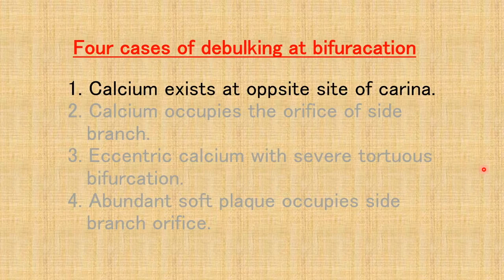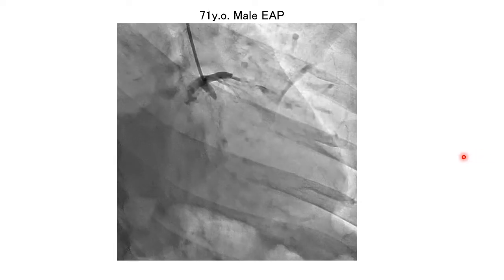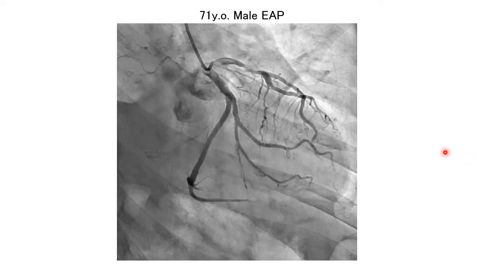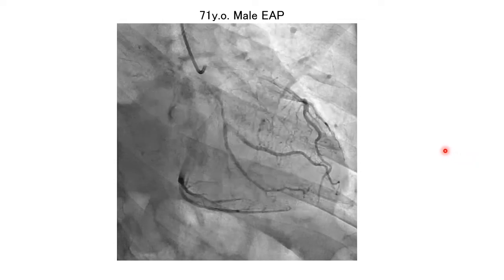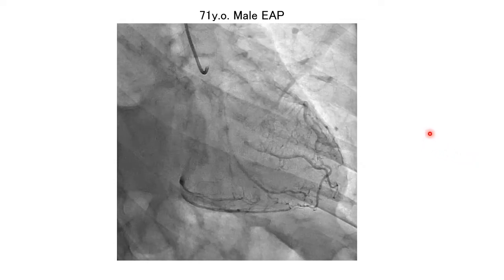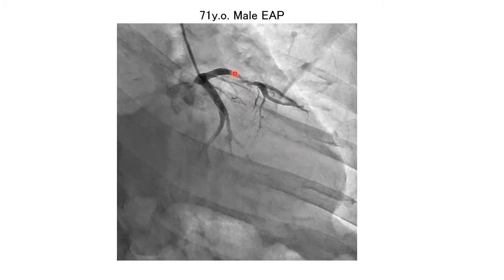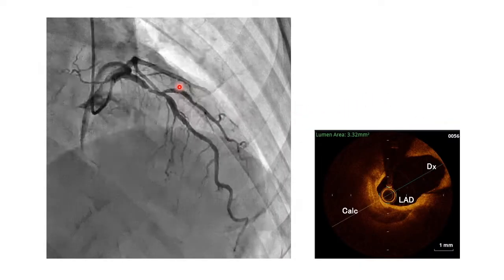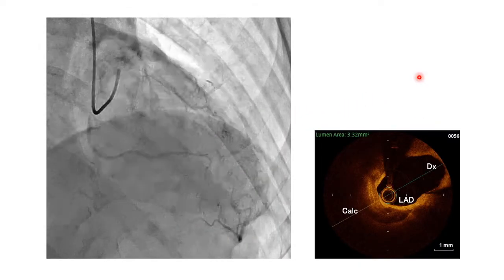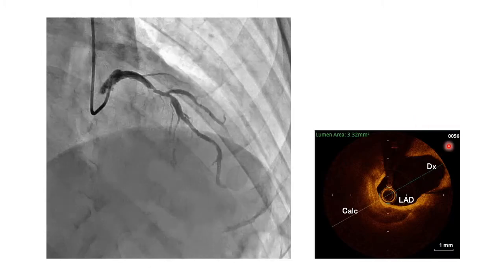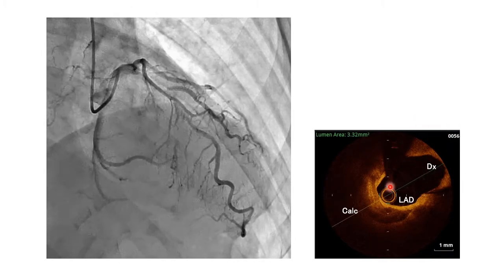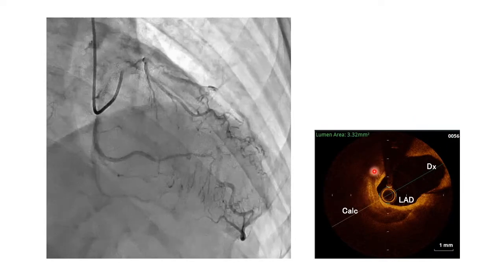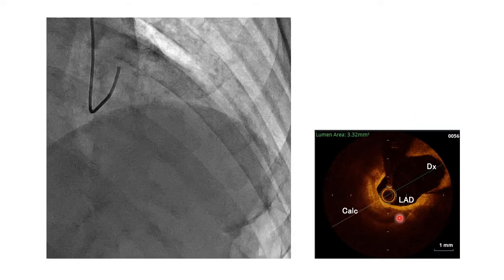The first case is calcium existing at the opposite side of carina. The case is a 71-year-old male with effort angina. You can see the severe stenosis in LAD involving a diagonal branch. OCT shows calcium at the opposite side of the diagonal branch.